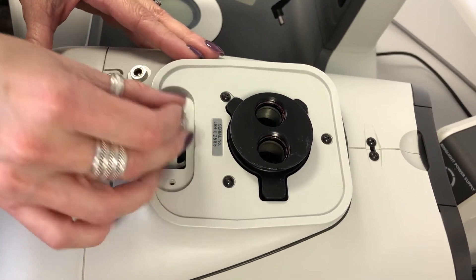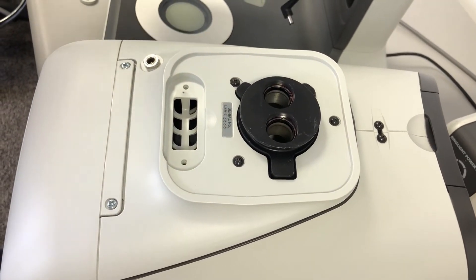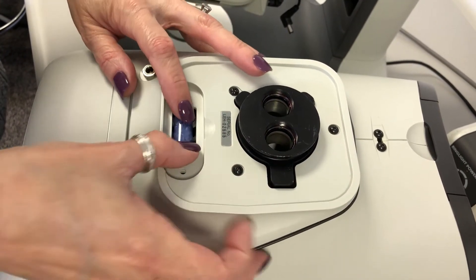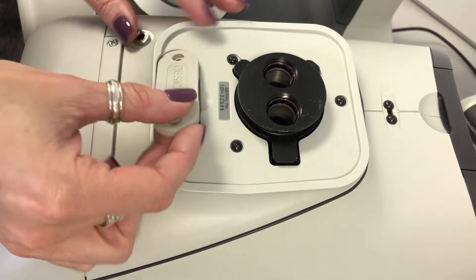Remove the expired desiccant and replace it with a fresh desiccant cartridge. Replace the cover.